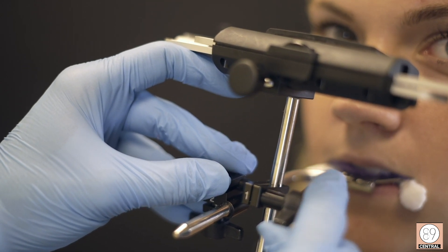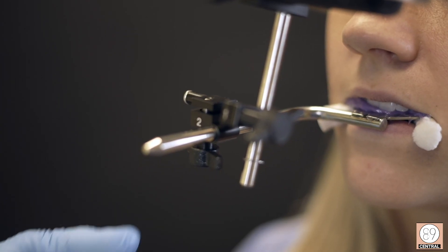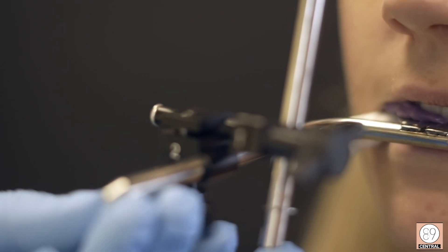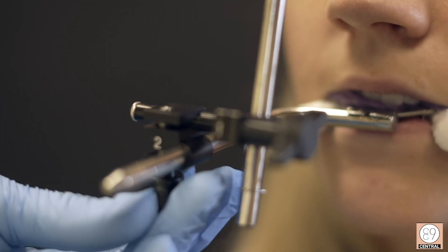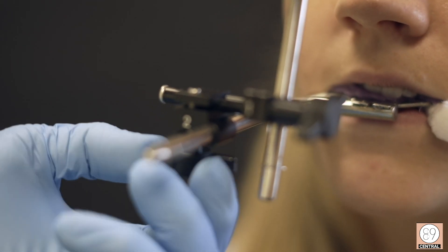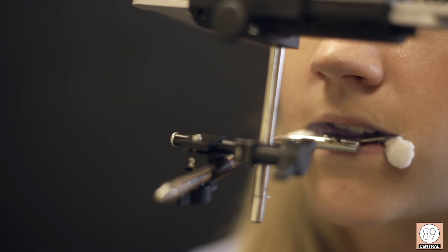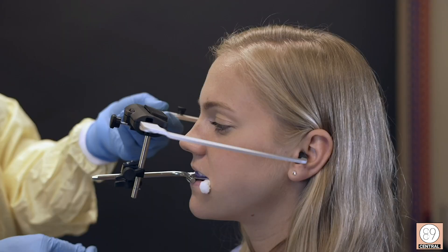The second position is your sagittal plane, so you just want to make sure that the fit in the left and right direction is passive on your bite fork. Your third position is anterior-posterior, so just be sure that your transfer jig isn't stuck on your bite fork and that the position is passive.